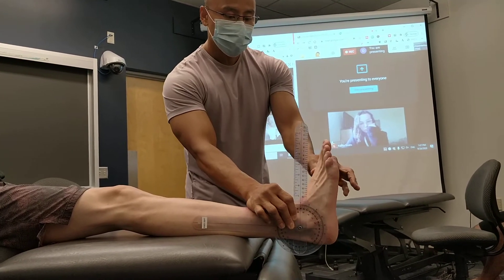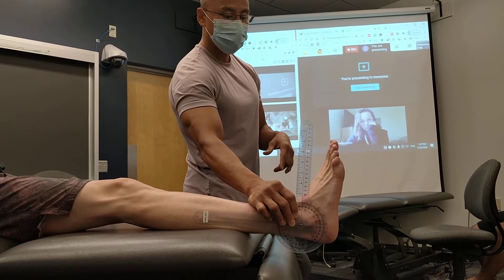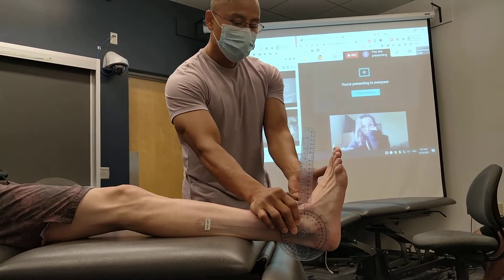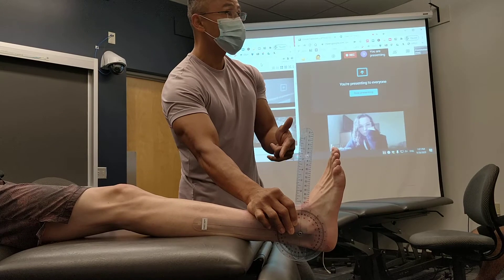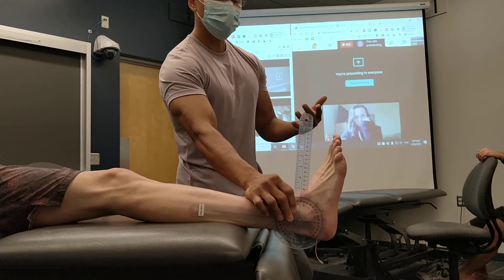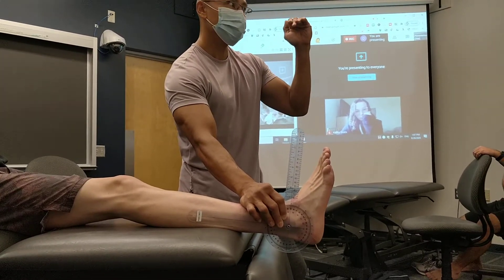Now, there are several landmarks you can use. The latest one I saw — I just started researching online — because you're looking at the movement at the talocrural joint, you're looking at the surface of the calcaneus, really. We've seen — who was the dancer with the really curvy foot?